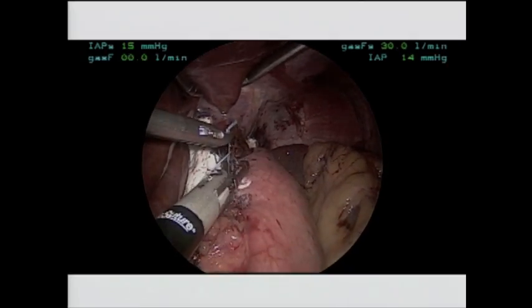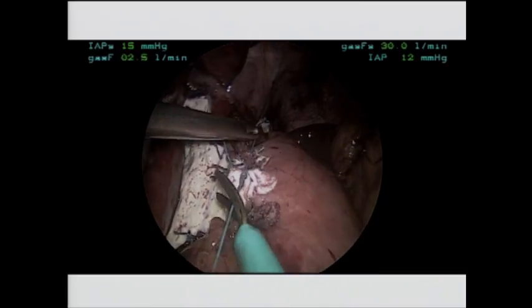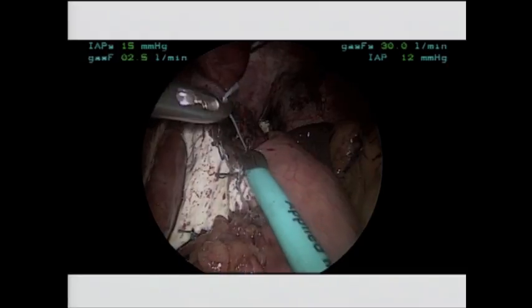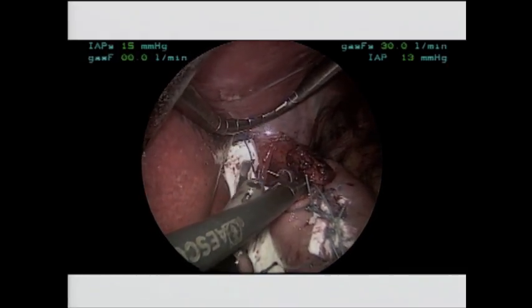And then finally, I've skipped all the sutures going in. We do not put a pledget on the most superior suture. It'll always roll over and touch the esophagus. That's the last pledgeted suture. There's three of them. Notice that tied against ourselves so that we didn't lift up on the sutures and maybe tear that out of the esophagus.